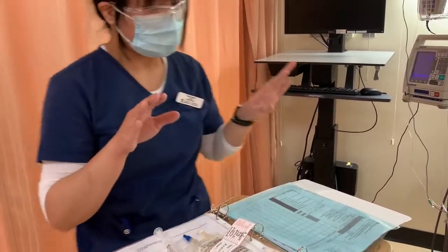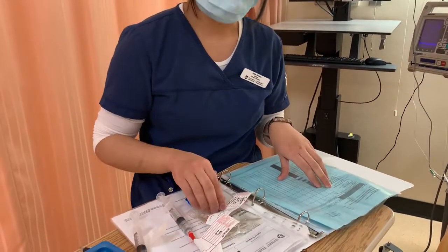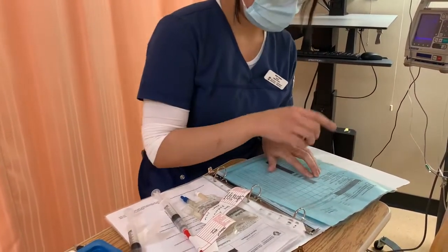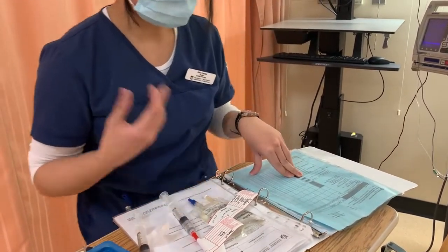So now I've already checked the right dose. It's a PCA, so I know it's an IV. It's a mini bag. It says IV here, so it's the right route. The lockout interval is 5 minutes. It's due to be changed now, so that's the right time as well.